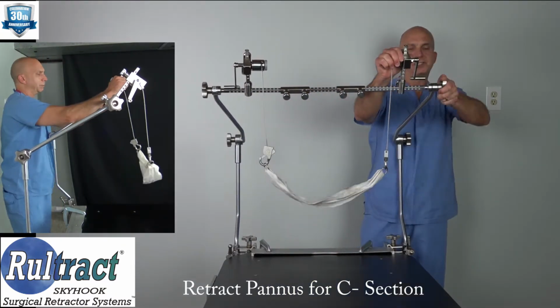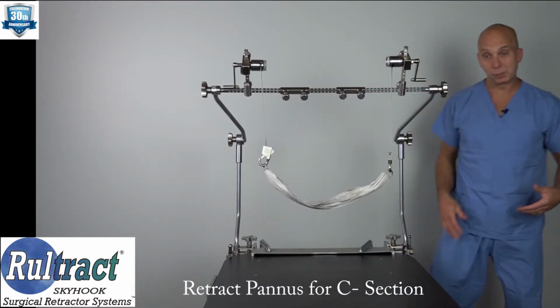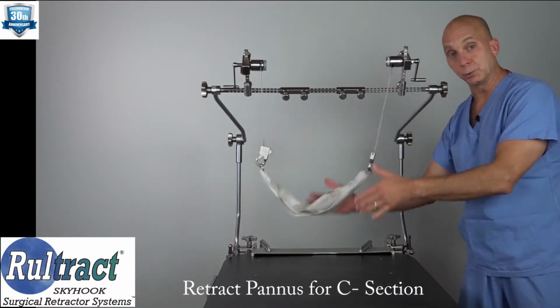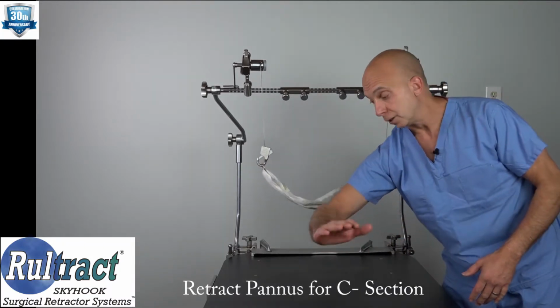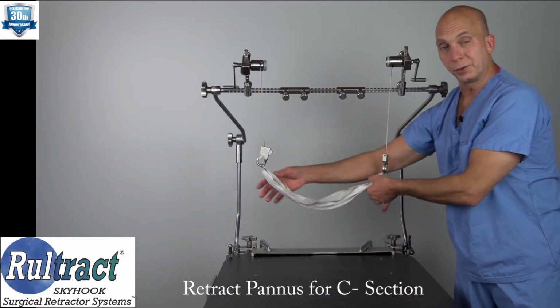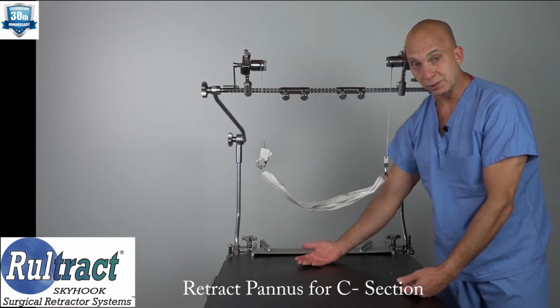The nice thing about this is it can be adjusted so many different ways, depending on how much space you need. If you need to move this back out of the way, you can lower the cables down further toward the pannus. I know that you said we try to move it back about 45 degrees. So if I'm here and I'm trying to move it back 45 degrees, will this work in just suspending the pannus over the patient's chest?